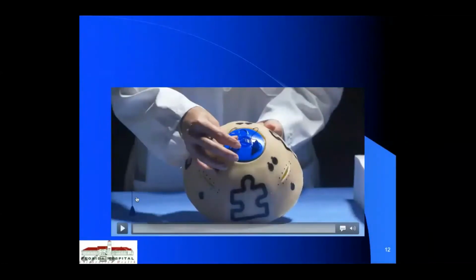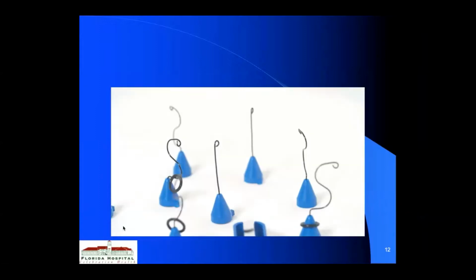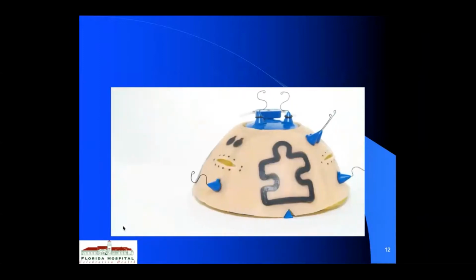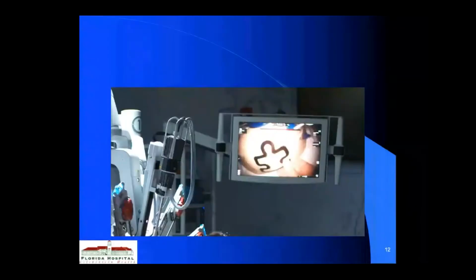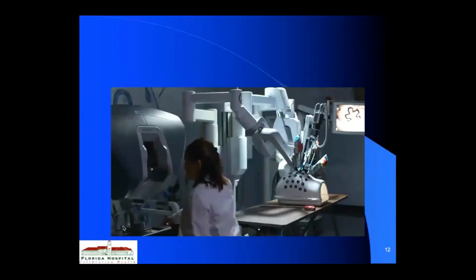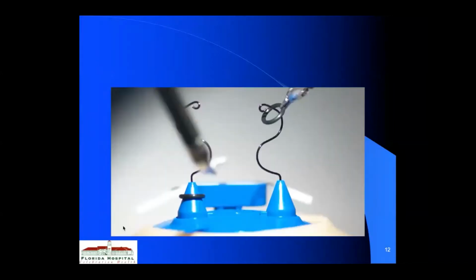What we do now is through the various models we have, using different robotic systems, practicing our hand-eye coordination, and I think there's going to be more of a hand-eye coordination test as residents and fellows come out. It's not going to be just based on letters that you receive from your professors. We can take our robotic technology and do it in a reproducible way in our lab and assess your surgical skills. It's not going to be just about how many cases you've done. We're going to have to practice on simulators, and then we're going to see where your deficiencies and strengths arise in your ability to perform certain operations.